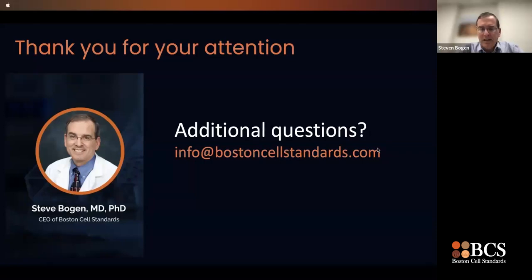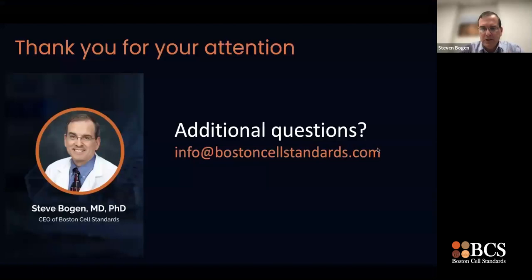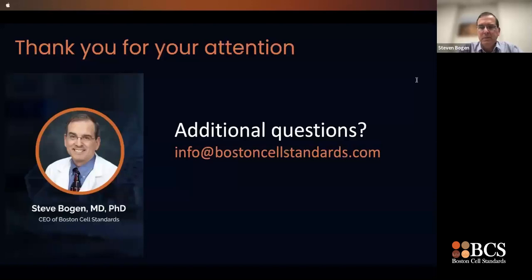Good question. There's no one answer to it, but let me answer it in a different way. If you're using manual IHC, or whatever the limitation, or something is not quite in the final version, such as the detection system, the key part is this: if you find in preclinical work that it's effective, that you're seeing distinction between the two groups you're trying to distinguish, then regardless of how you change the assay, such as automating it or putting in a new detection system, you need to be aware of the cut point.